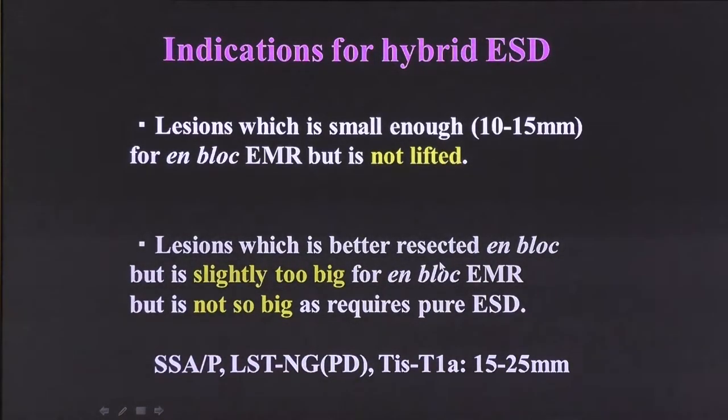And this indication includes lesions 15 to 25 millimeters in diameter, such as SSAP, LST pseudodepressed type, or intramucosal or slightly invasive cancer.